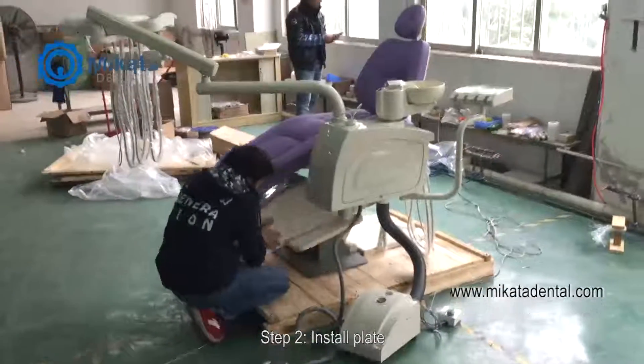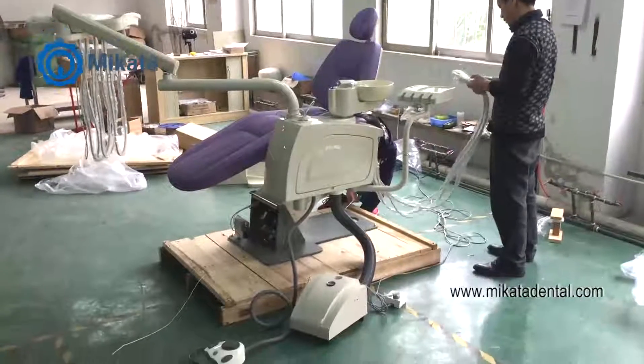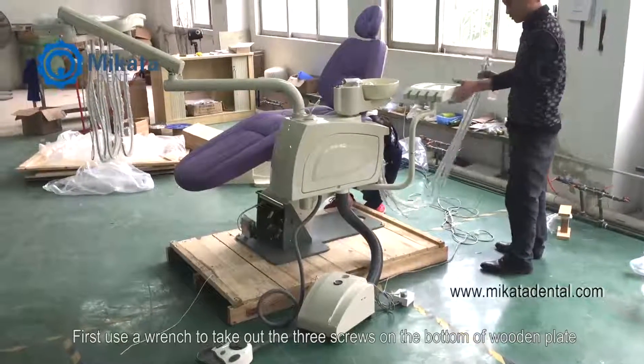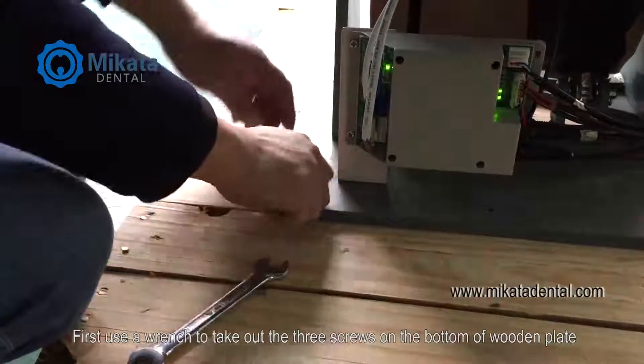Step 2. Install plate. First, use a wrench to take out the three screws on the bottom of the wooden plate.